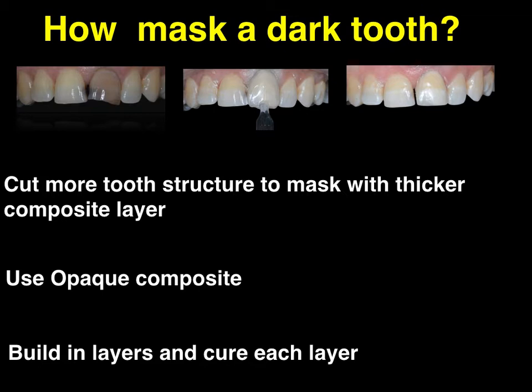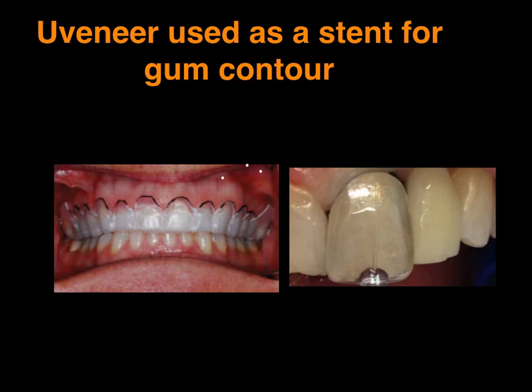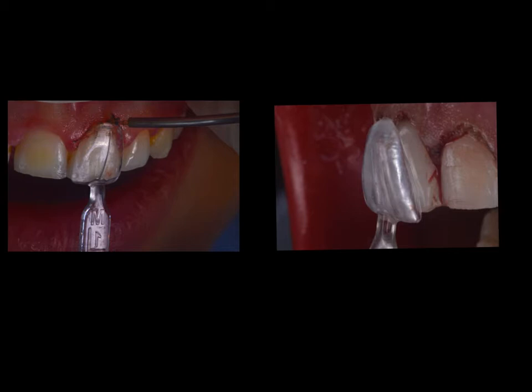You can also use the Uveneer as a stent for your gum contouring instead of creating a stent with the lab. This is how you apply. You apply the Uveneer on the gums. You create bleeding spots with your probe. Remove the Uveneer and follow those bleeding spots that you created with the probe and cut with the laser.